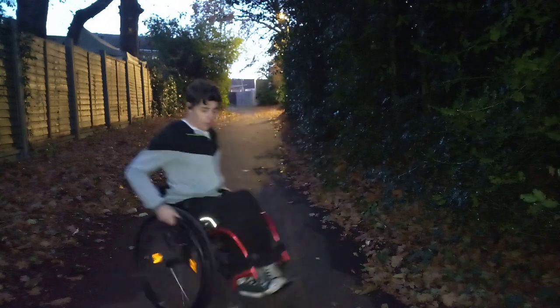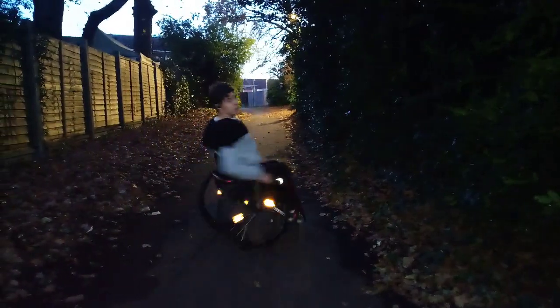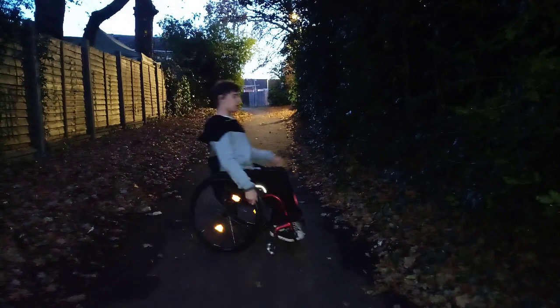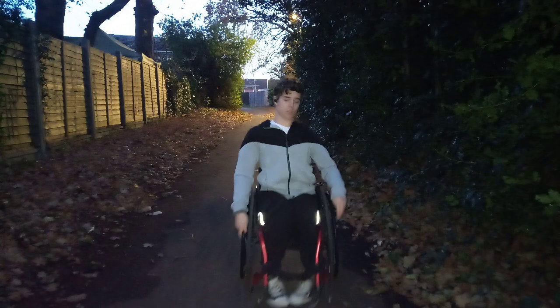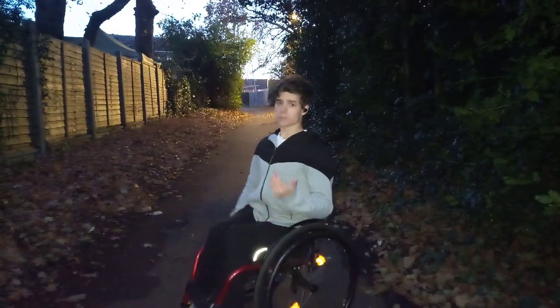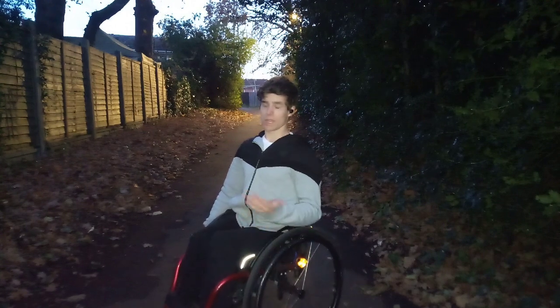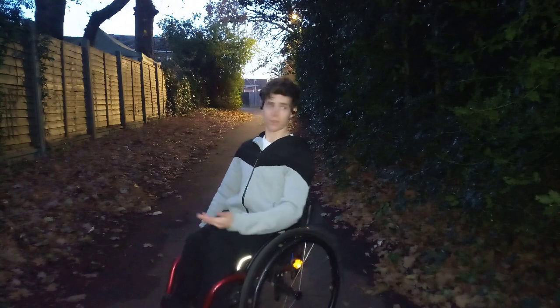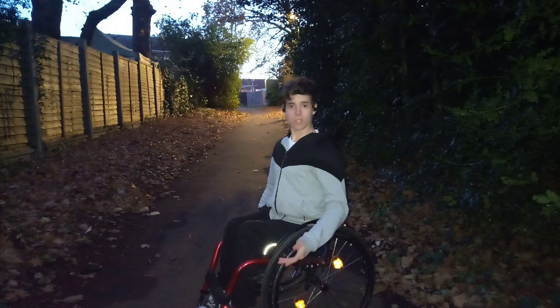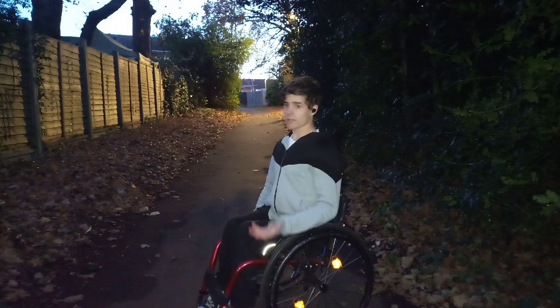Preferably keep your wheels quite low to the ground. For me, I'd recommend doing just a slight back wheel balance, keeping them just above the snow, maybe even touching the snow, and giving just some small pushes. I've got an entire YouTube video about back wheel balance if you're interested, and also how to move with it. But these are the two main issues that I think you'll find pushing in colder climates, just because it's either going to be snow or ice.